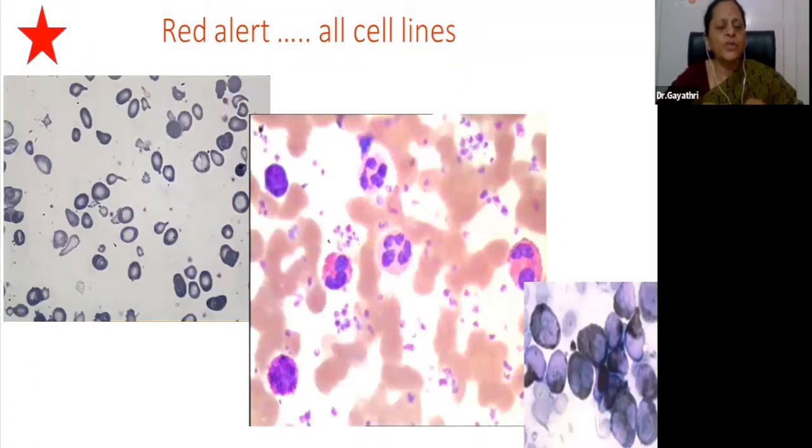When there is so much leukocytosis, is there also accompanying change in the red cells? Whether there is leukopenia or leukocytosis, if you see so many teardrop cells, occasional nucleated RBCs too, so much variation in red cell morphology, you should suspect that there is something more going on in the marrow stroma, and that would be myelofibrosis. So teardrop cells must ring a bell to suspect myelofibrosis.